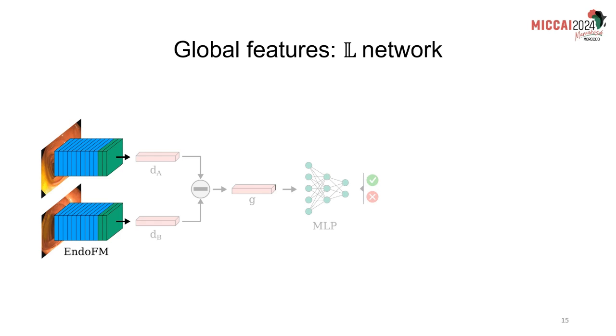Now that we have explained the algorithm, there is a big question still remaining: how do we find these co-visible relationships between different submaps? We have two ways in this work. The first one is by global features with our network.